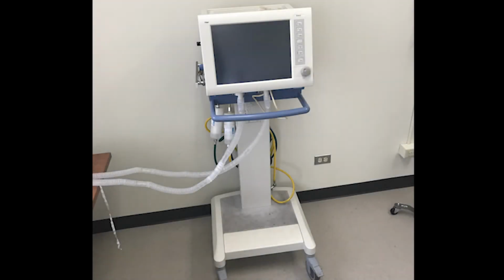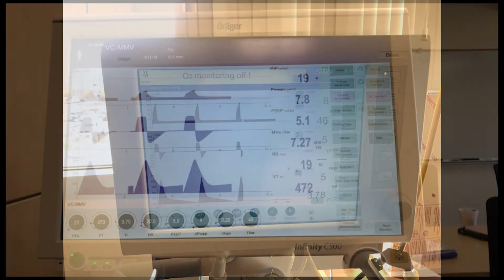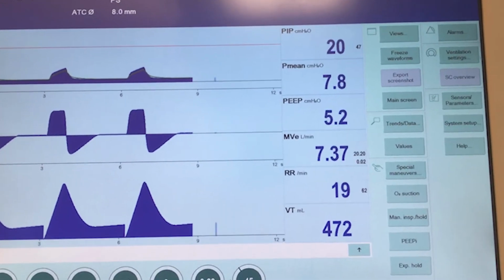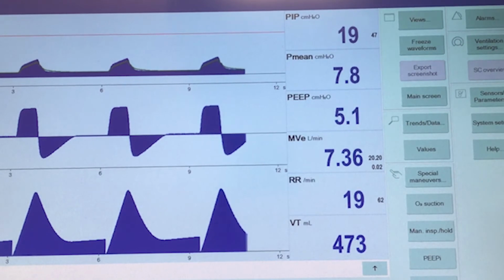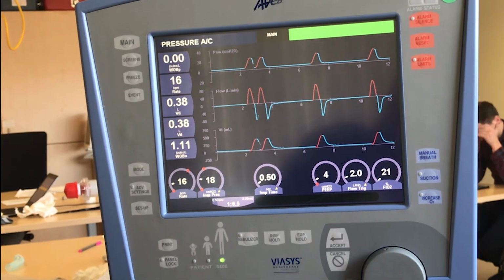The fourth and current generation of ventilators are by far the most sophisticated and advanced ventilators on the market. They have extensive monitors and alarms like no other ventilator has had. They offer a variety of new modes of ventilation, and they are able to provide invasive and non-invasive ventilation with the same machine. They can monitor and calculate countless values.